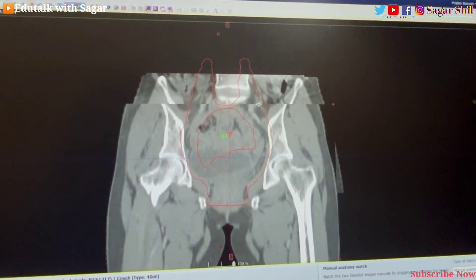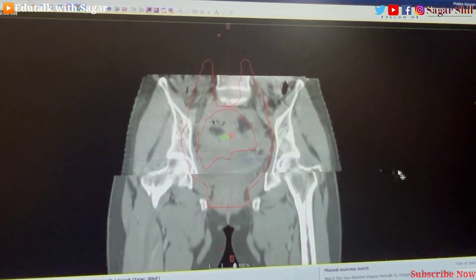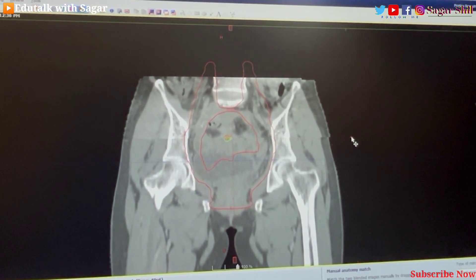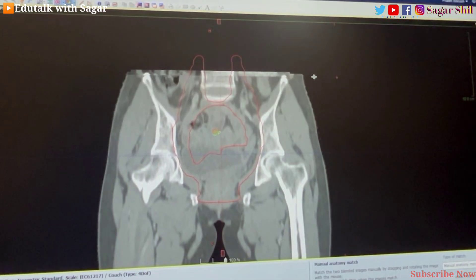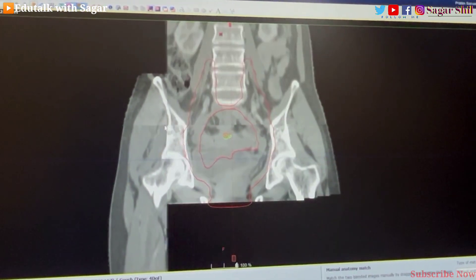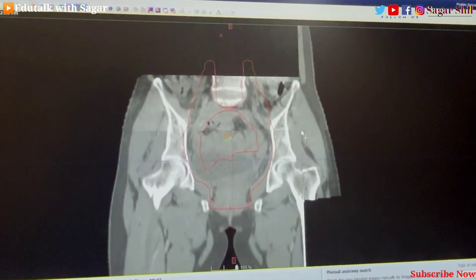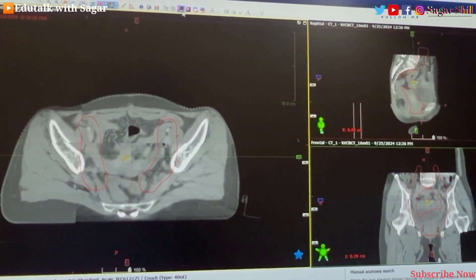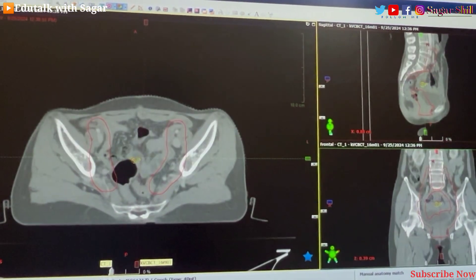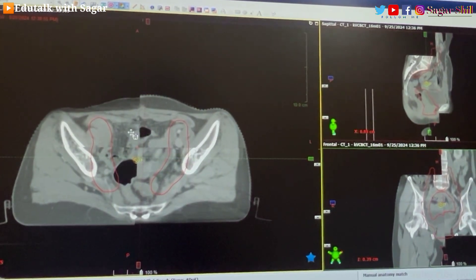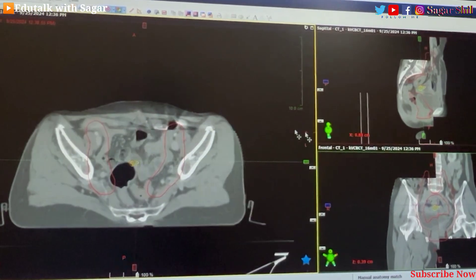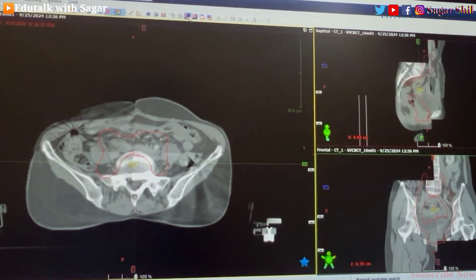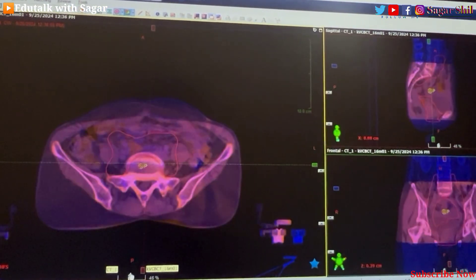I am creating that lateral variation — you can see how much variation is there, that is lateral variation. With the help of the split window you can match the lateral images as well. This is not a very big thing. If you are able to see the variation with both images, you can match the CBCT image. In the transverse view you can match also. You can compare both images with the split window.